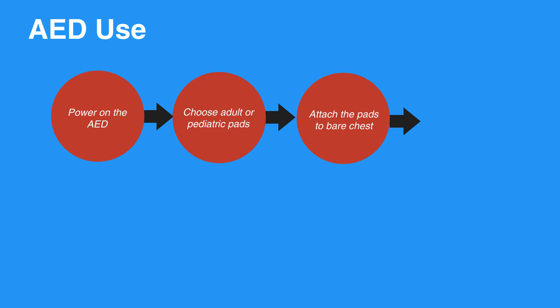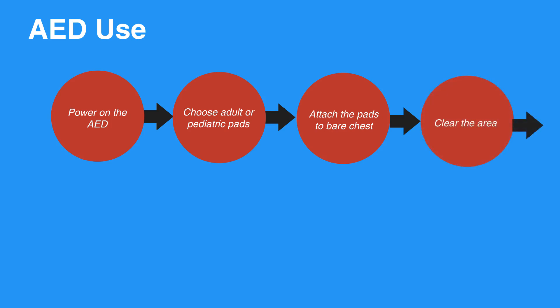Be sure not to attach the pads over any medication patches, and dry the chest if necessary. Place one pad on the upper right side and the other on the chest a few inches below the left armpit. Clear the area to allow the AED to read the rhythm, which may take up to 15 seconds.